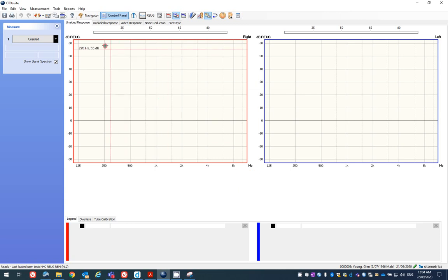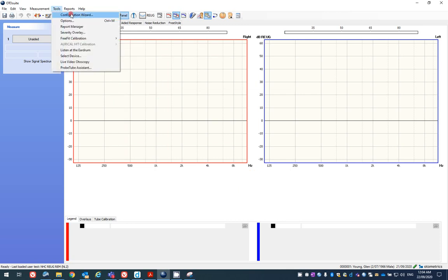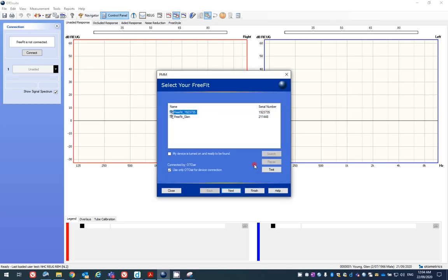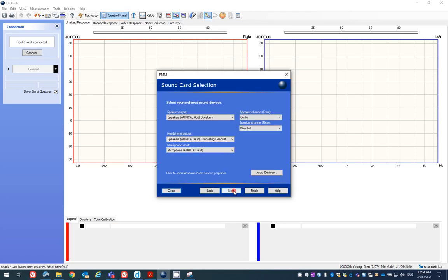So we'll close there. We'll go to Tools and Configuration Wizard. And next to our probe mic measurement, we'll hit Configure. And we'll confirm that, first of all, we're connecting to the correct Freefit. So I've checked that serial number and I know that that's the right one. Always want to make sure we've got this Use Only OTOair for Device Connection selected. So if we say Next, we can see the problem there. The front channel speaker is set to the wrong channel, so that needs to be set to the right channel.